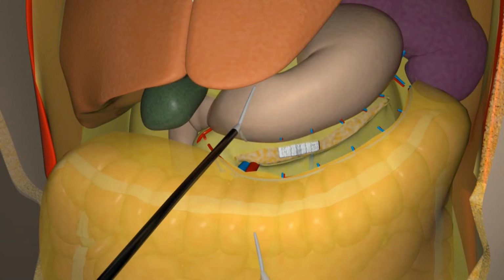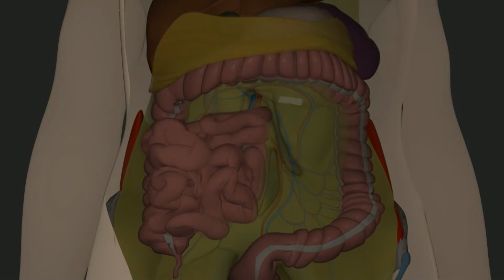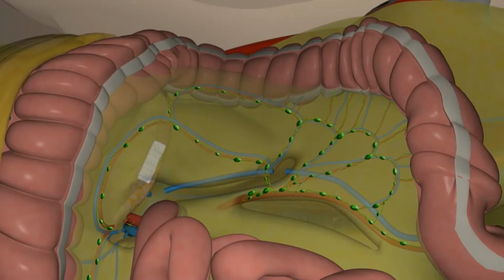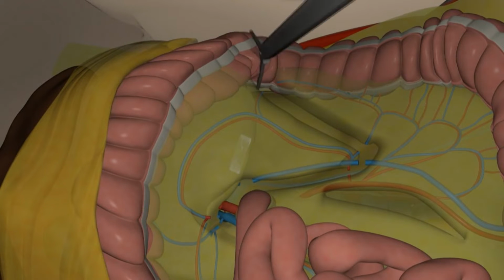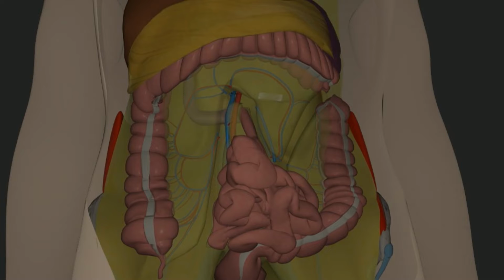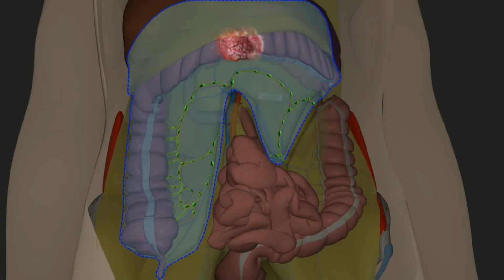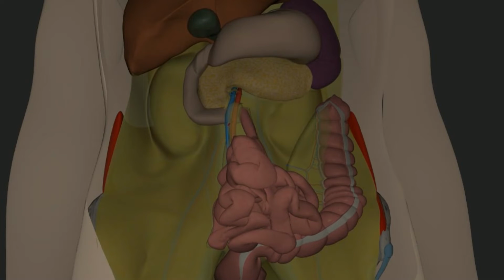This is followed by transection of the distal and proximal margin of the specimen. The distal resection margin is prepared and the descending colon is transected at least 10 to 15 cm distal to the edge of the transverse colon cancer. The terminal ileum is then transected, which will allow complete removal of the specimen at the conclusion of the procedure, with easy reach of the colon for an adequate resection and easy anastomosis.